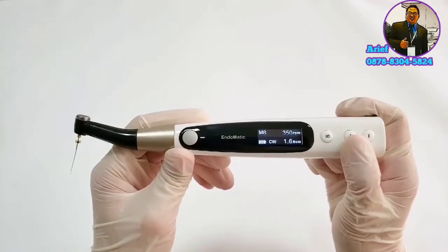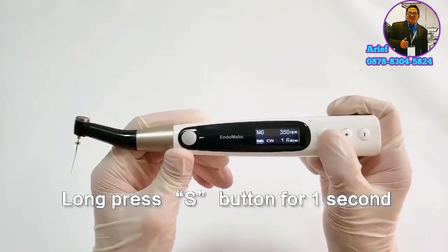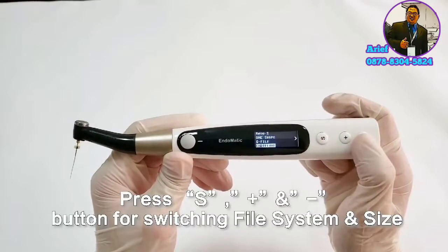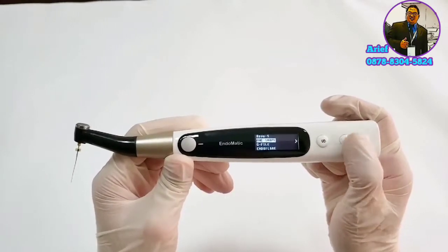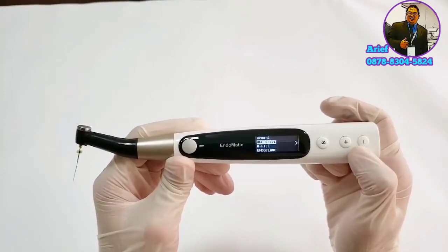You can select different file systems according to your demand. Long press the S button for one second, then you can select these 30 file systems and file size by pressing the S button and the minus and plus buttons.